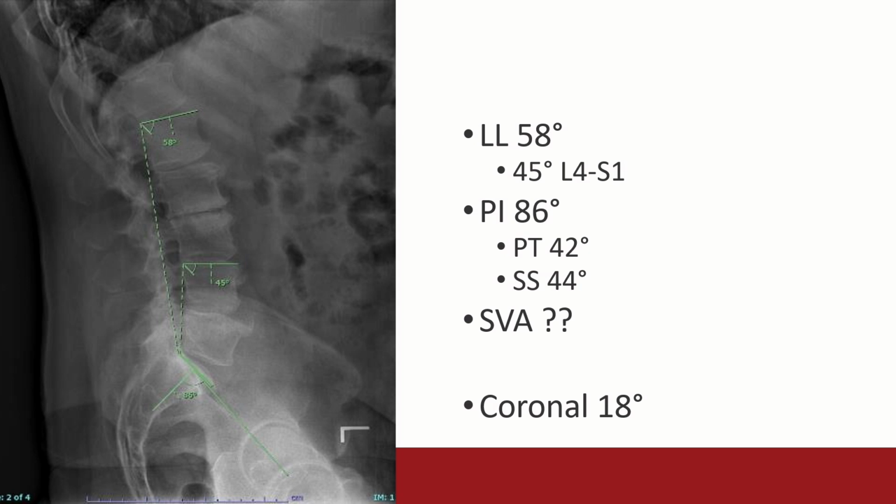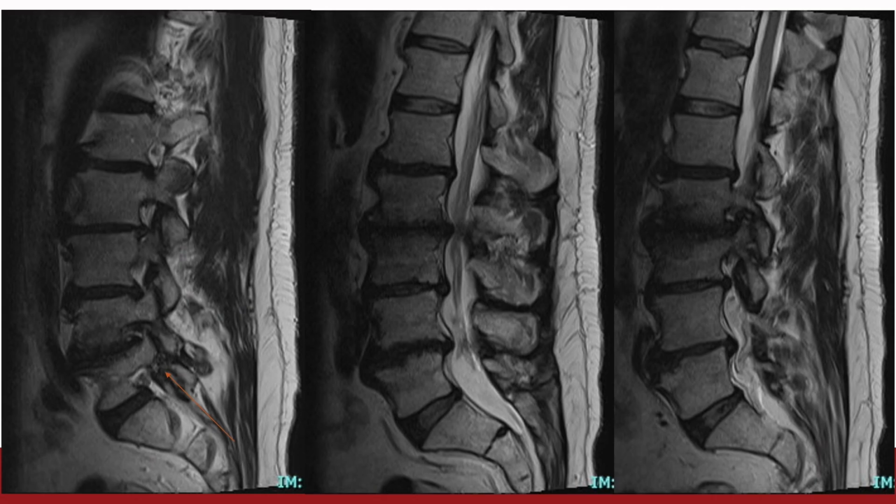But take a look. What's abnormal? Their pelvic tilt. 42 degrees, right? So you take a look at that, and there's deformity elsewhere. There is upper thoracic or thoracolumbar junction deformity based on these x-rays. Probably upper thoracic spine is driving this patient's retroversion. And so when I'm thinking about resolving a monoradiculopathy and not doing heroics, I think a multi-level lateral is probably a very reasonable operation with minimal morbidity.